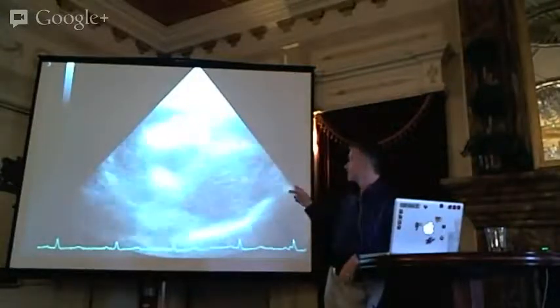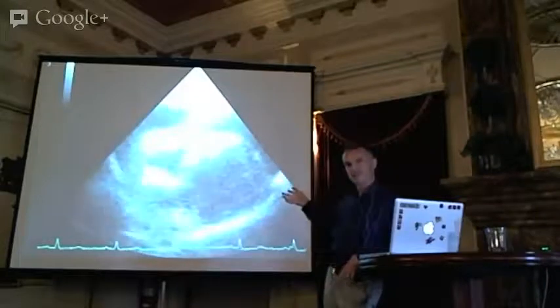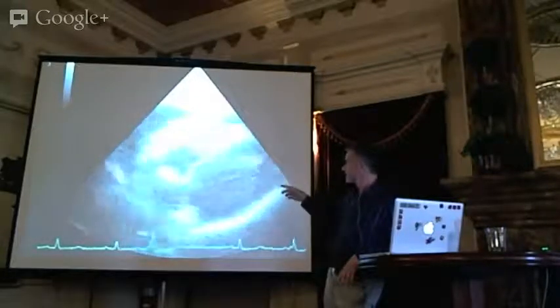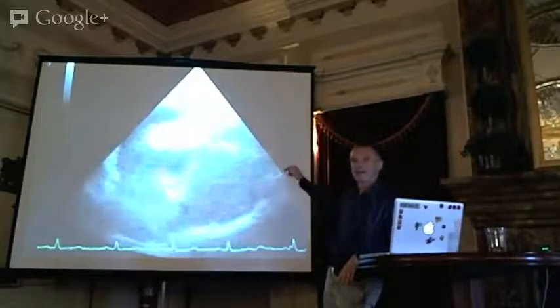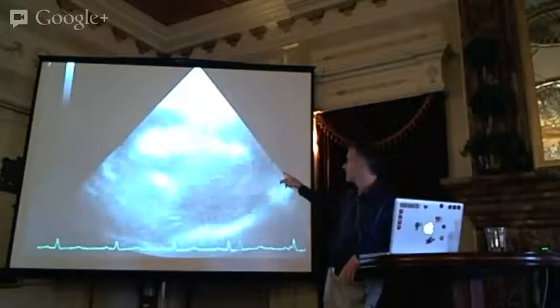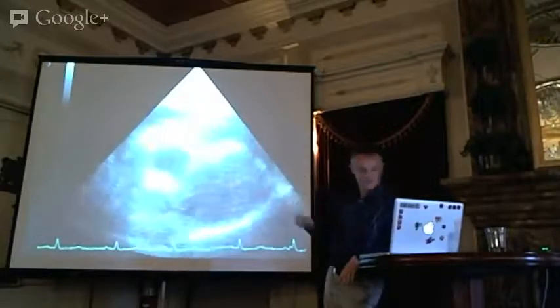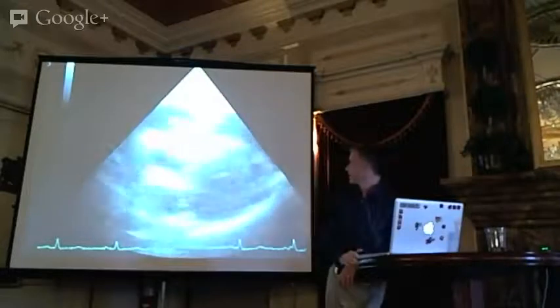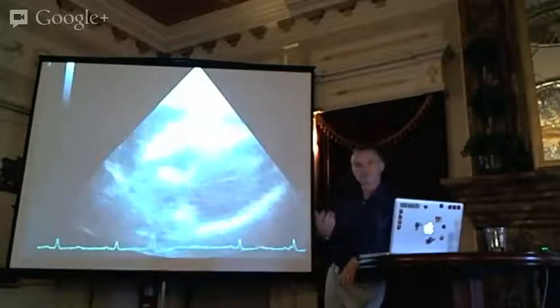And with the heart going this fast, and you're barely used to cardiac ultrasound, that's kind of hard to see, but it was described by someone smarter than me that it looks like someone's jumping on the right ventricle. It does look funny, doesn't it? The right side of the heart, the top bit of that image, has a right ventricle diastolic collapse. So that's a feature of tamponade physiology.